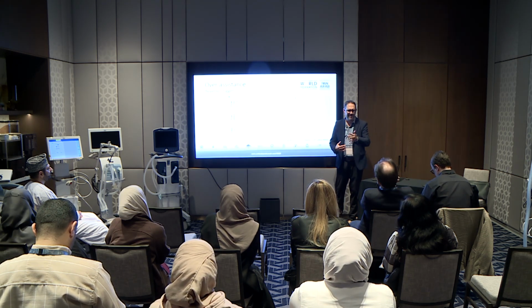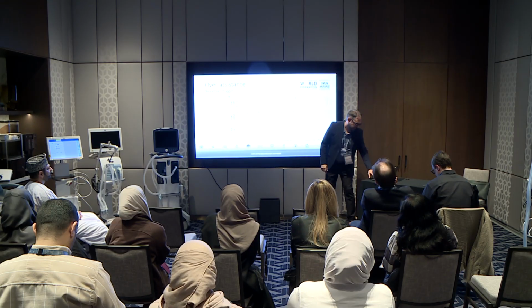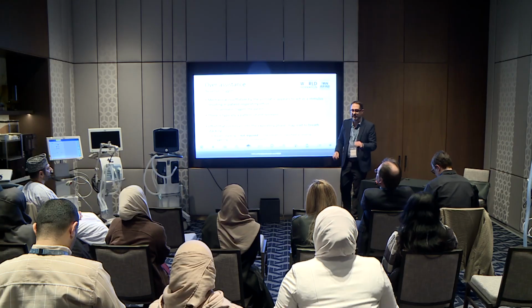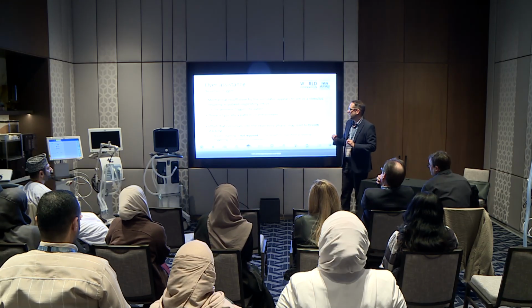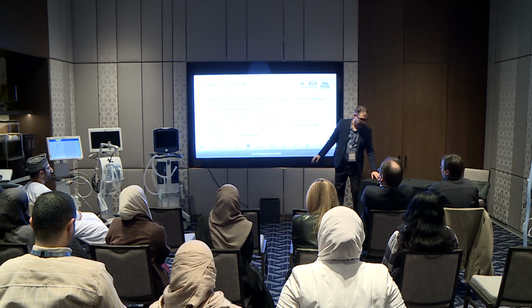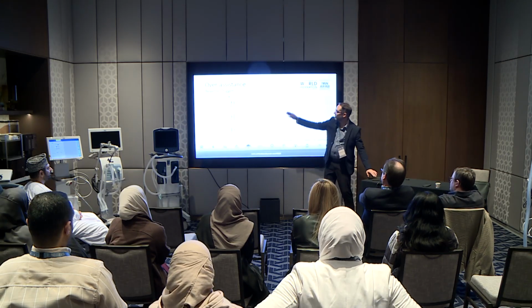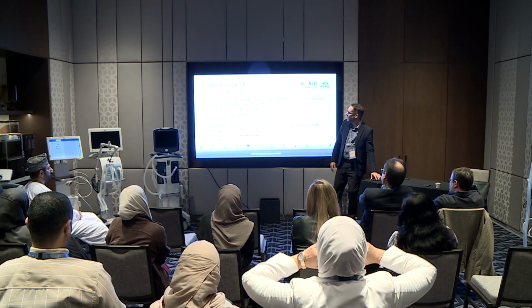I think the reviewers of that paper argued that it's not a full eccentric contraction, so they call it post-inspiratory loading. But reverse triggering is the main problem. How do you correct it? Well, it typically happens in over-sedated patients. So it happens as insufflation appears to act as a stimulus, and the patient triggers. It happens usually in a ratio. I'll quickly point out that this was 1 to 2, 1 to 1, right? So it's usually very rhythmic and very patterned.